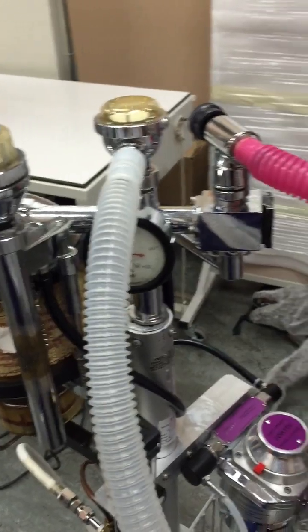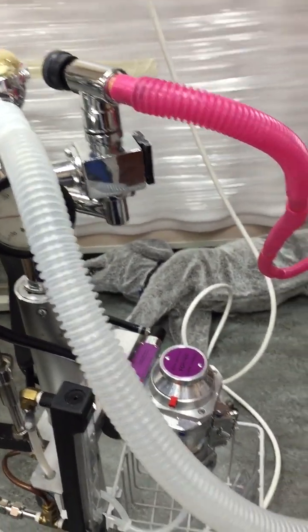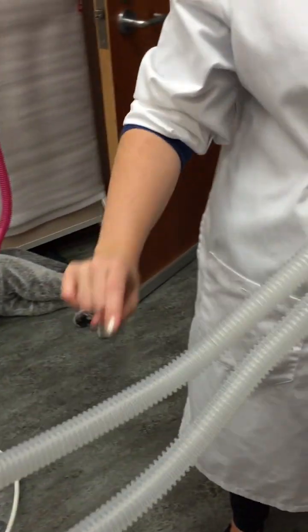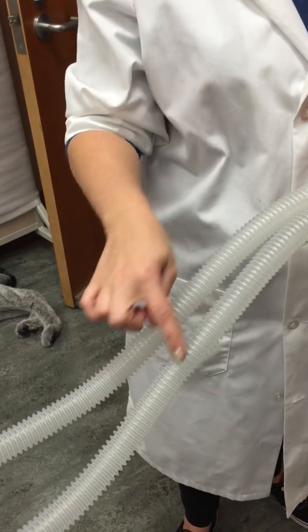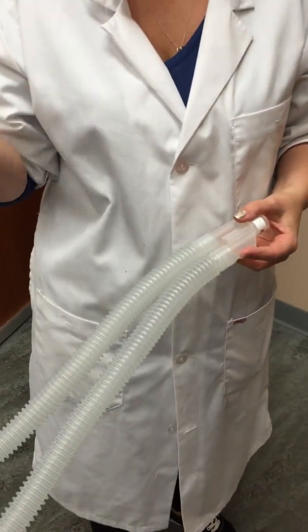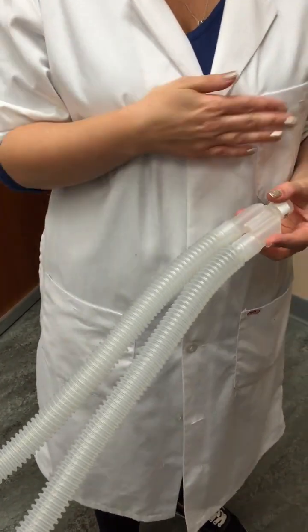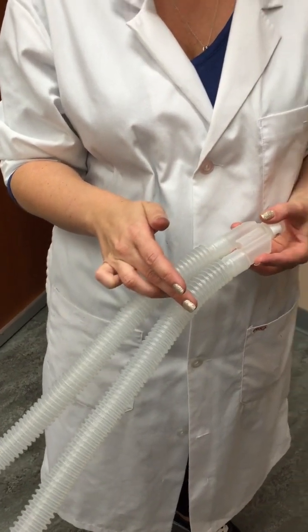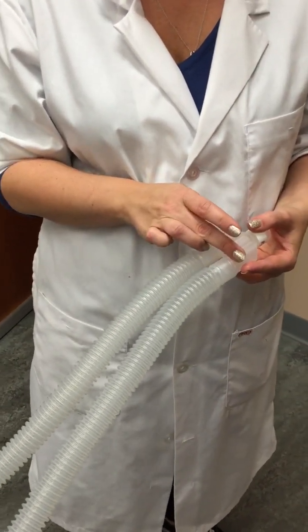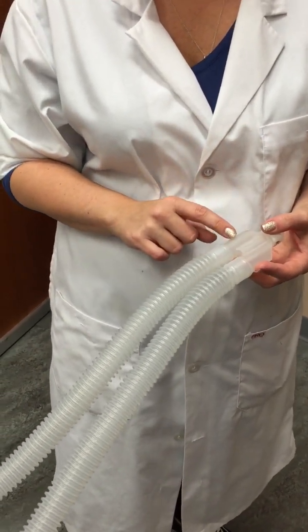Now, people wonder why the exhaled breath goes down this expiration limb, and the reason is that the gas takes the path of least resistance. This inspired limb already has constant oxygen flowing into your circuit and your patient. So the exhaled breath has to push against this, so it won't go up here if your oxygen rate is high enough at the proper rate calculated for your patient.